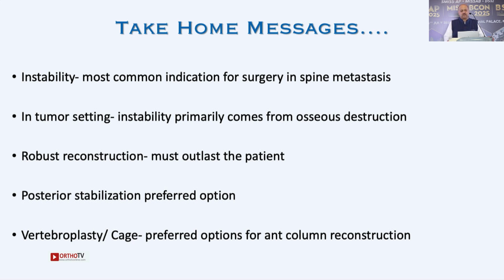Posterior stabilization is the preferred option. And in my practice, I like to use a cage which I pack with bone cement, or I use vertebroplasties more and more frequently if we've caught the disease early.